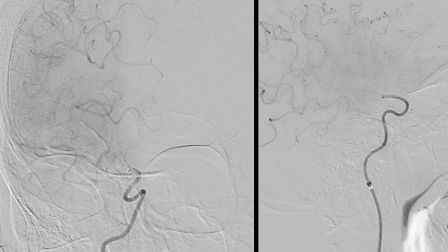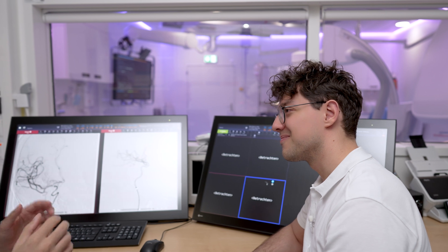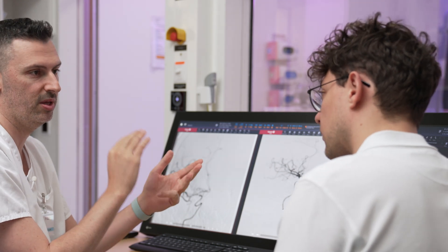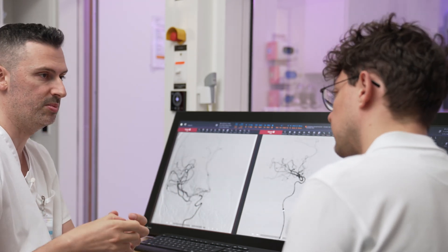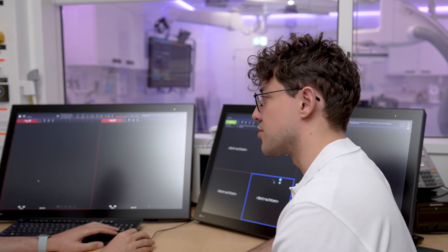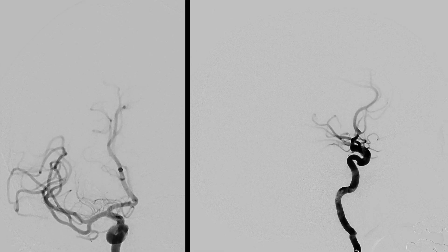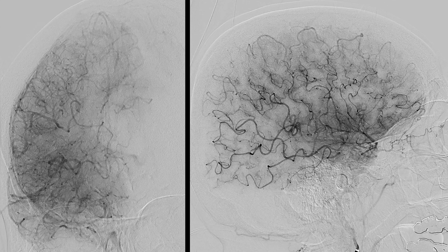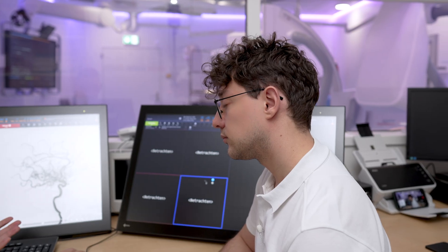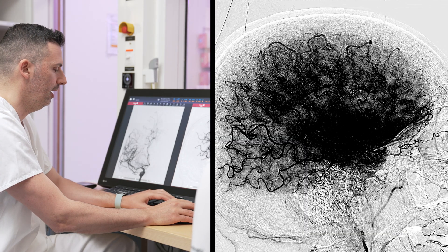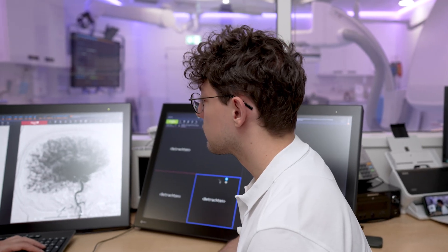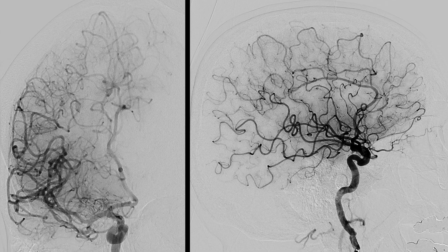What we did when we retrieved the whole thing was also put the aspiration catheter in place, and then we retrieved the whole system — stent retriever, small aspiration catheter, and clot — towards the big aspiration catheter, which was not moved, but we used aspiration. So what we sometimes call it, the first name of this quattro technique, was SAVE to solumbra: you pull back the unit — stent retriever, small aspiration catheter, clot — to the big aspiration catheter which you don't remove. And how did it go at the end? Is the patient all right? It went really well. The patient was actually asymptomatic at the end of the procedure. She came with an NIHSS of over 10 and couldn't move the left side of her body. And this was the result — the reperfusion after the proximal thrombectomy and also the distal thrombectomy with the smaller materials.